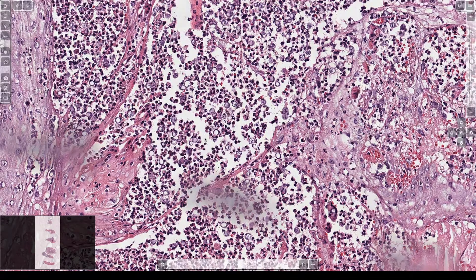So that's classic for blastomycosis. They're much larger than a lot of the other yeast, and they're very uniform in size.